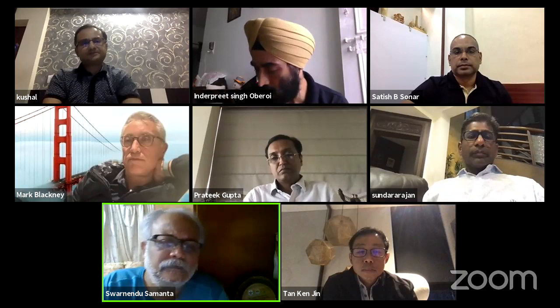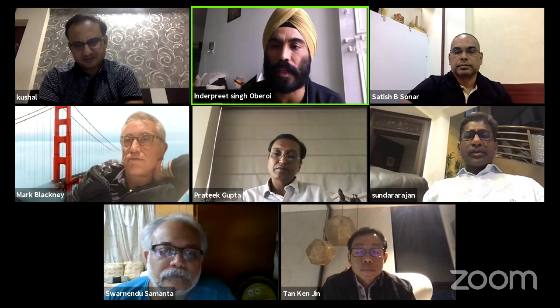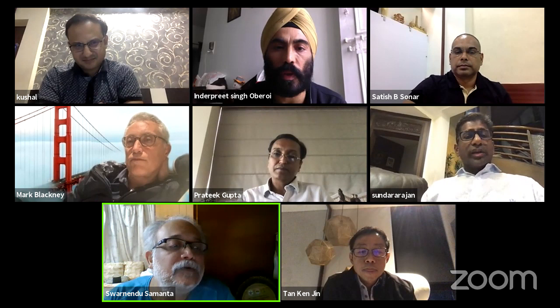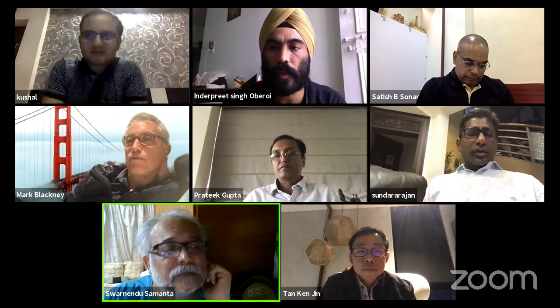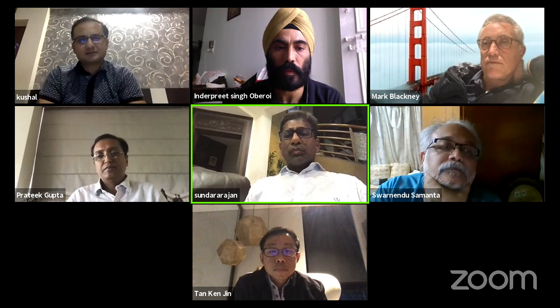There are two more questions coming in. Number one is for you, Sundar. There are fancy traction devices which are available. Would you recommend buying those traction devices for ankle arthroscopy? Unmute yourself, Sundar. You are not audible. Yes, Sundar. Sorry. In my opinion, it's very cumbersome. It will not allow you to move freely here and there. You just need to hold your foot and do a plantar flexion, and give a slight traction with your assistant. It is easy to do the traction.